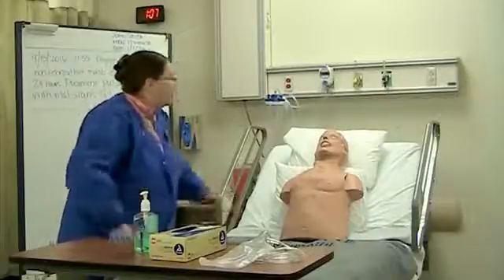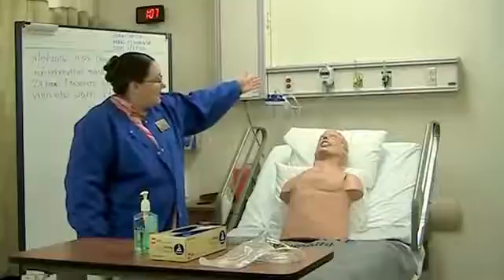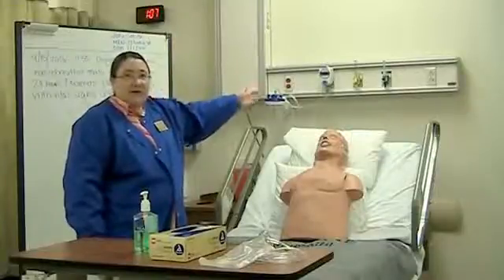After I've finished my chart review, I'm going to verify that I have all my equipment. I have my hand sanitizer, my gloves, my non-rebreather mask, and behind the patient's bed you can see the flow meter and the Christmas tree adapter.